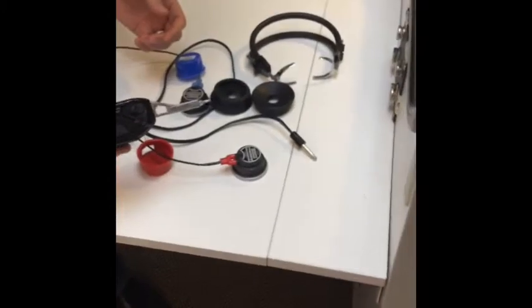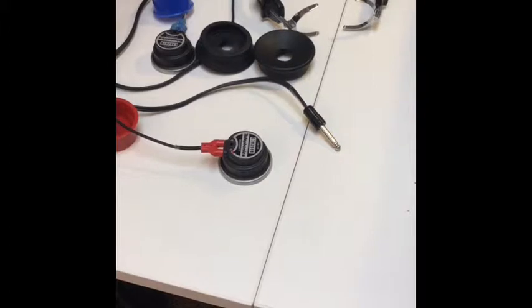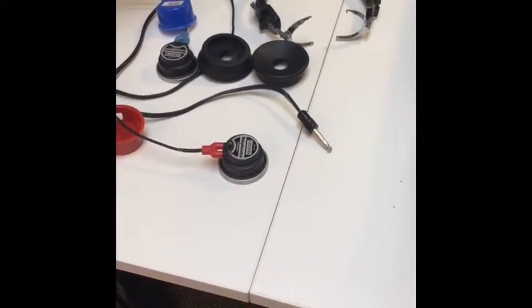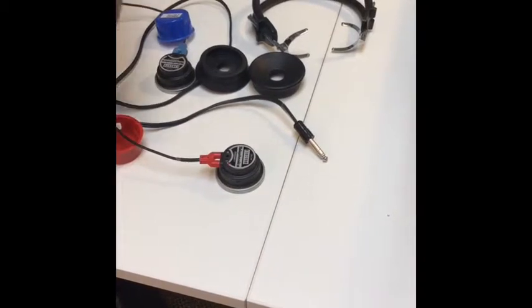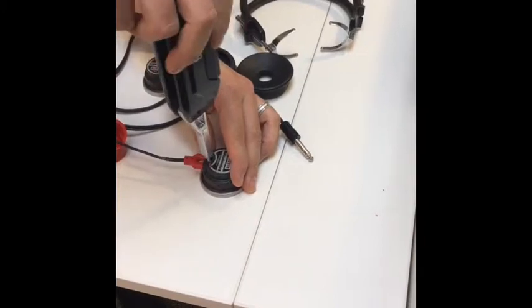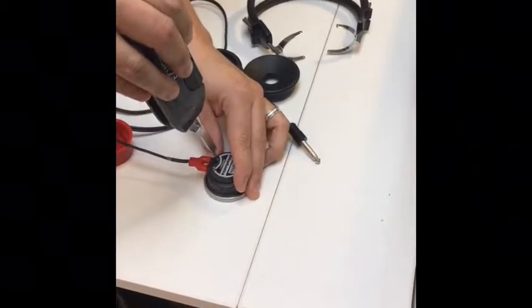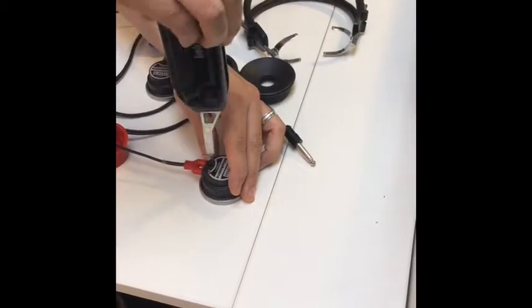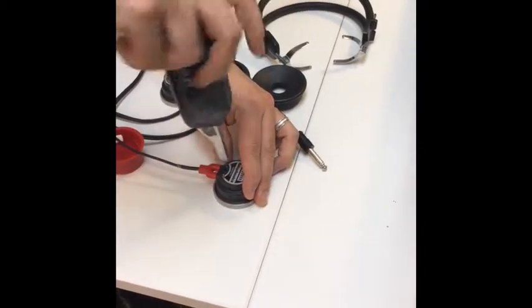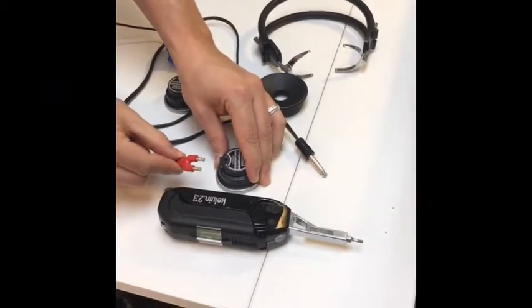What's very important to note is when you're doing this, you do not want to take these screws all the way out. You just want to loosen them, not take them out. If you do and they fall on the ground, they're very hard to find and very hard to put back in. So just give them a couple of turns — maybe two or three rotations on each screw — just so they're loose but still in there. It should just slide out like that.